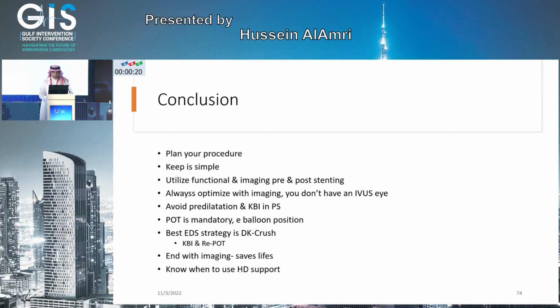Don't wait for complications. So make your procedure simple. Make it as provisional as much as you can. Avoid complications by avoiding complicating your procedure. End up always with imaging and optimize with imaging, which improves life and improves prognosis.